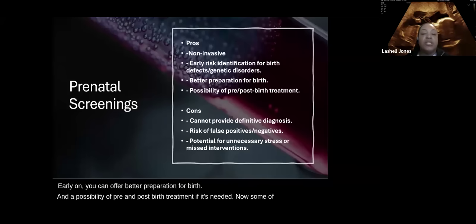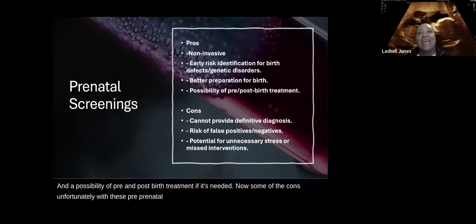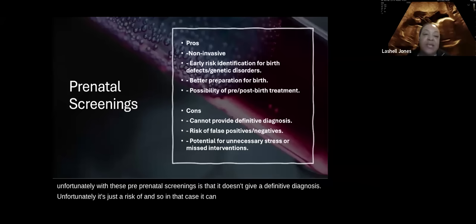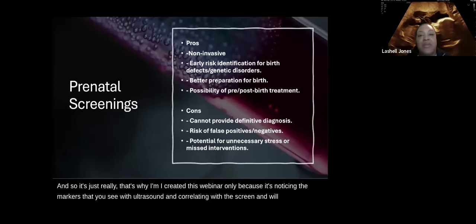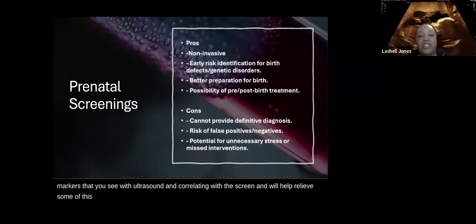Now, some of the cons, unfortunately, with these prenatal screenings is that they don't give a definitive diagnosis. It's just a risk of. And so, in that case, it can cause anxiety for the patient. That's why I created this webinar: noticing the markers that you see with ultrasound and correlating them with the screening will help relieve some of this anxiety for the patients. And so we're going to go over these ultrasound markers.